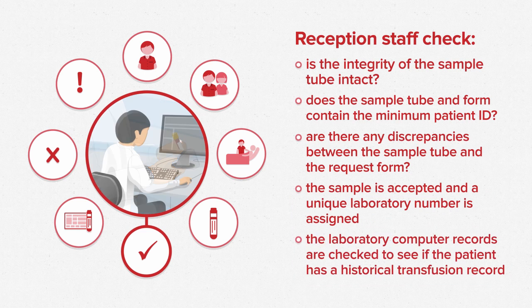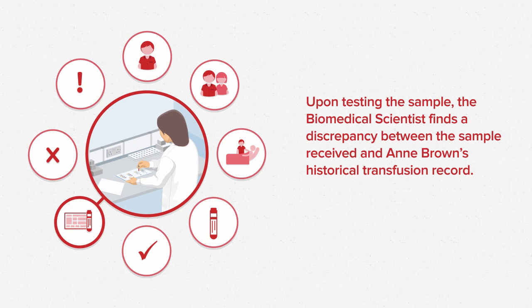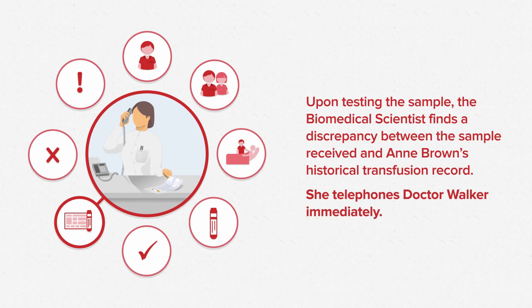Staff also check the laboratory computer records to see if the patient has a historical transfusion record. Upon testing the sample, the biomedical scientist finds a discrepancy between the sample received and Anne Brown's historical transfusion record. She telephones Dr. Walker immediately.